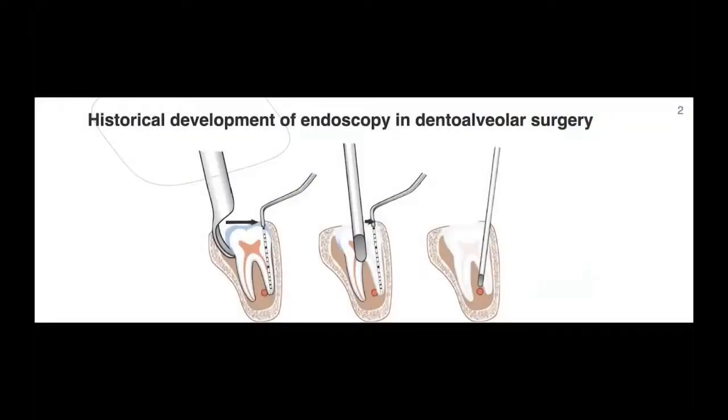Endoscopy has been used for decades as a supportive technique for directing minimally invasive oral surgical procedures, and in the latest years there has been increasing use in the endoscopically assisted oral microsurgery techniques, such as flapless implantology, apical microsurgery access, tooth extraction, especially in impacted tooth removal, sinus floor elevation procedures, tunnel techniques for bone regeneration, and periimplantitis treatment access in combination with laser system, for example.